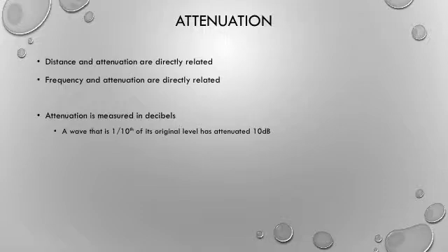Isn't it great that we have so many names for things in ultrasound? No? Why not? So much to remember. Oh, but it makes it easy. See, this way, if you're from the East Coast and you call everything half boundary layers, now they have to learn it as the half value layer.